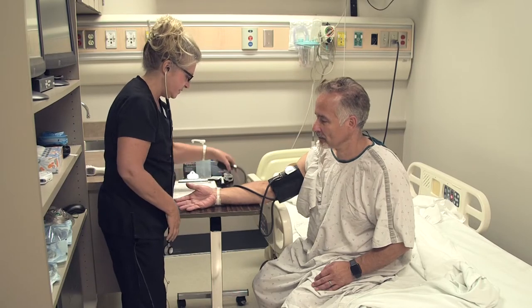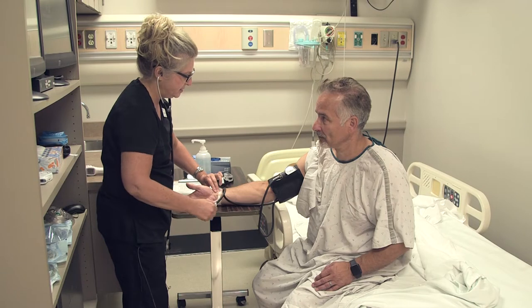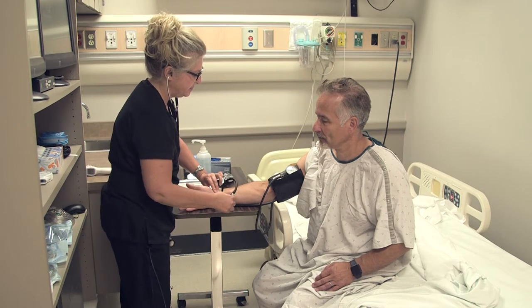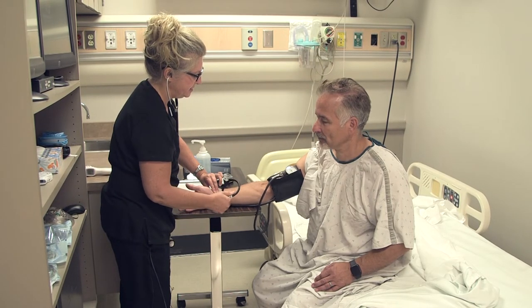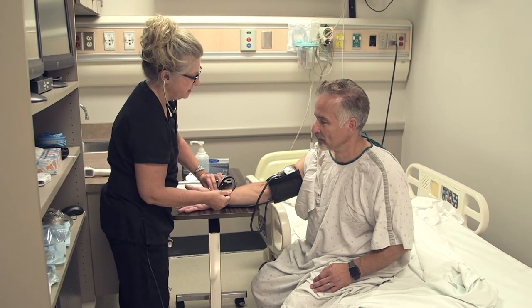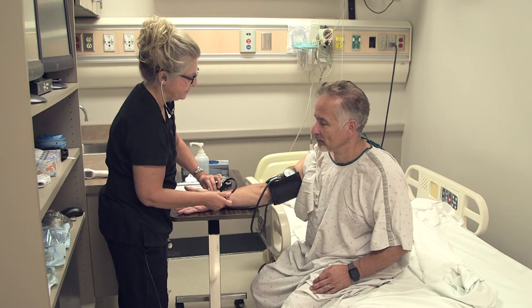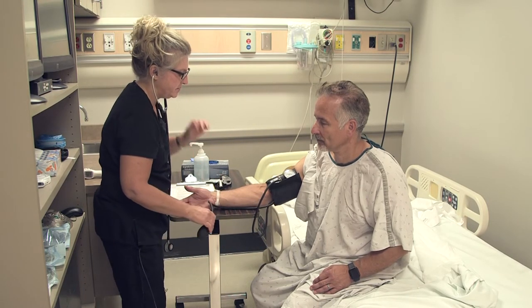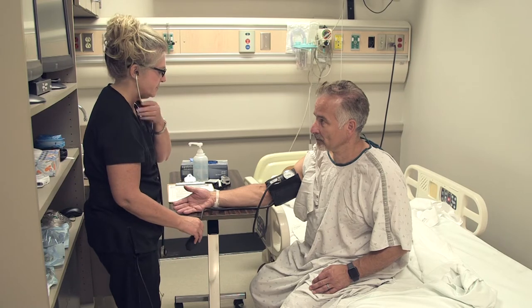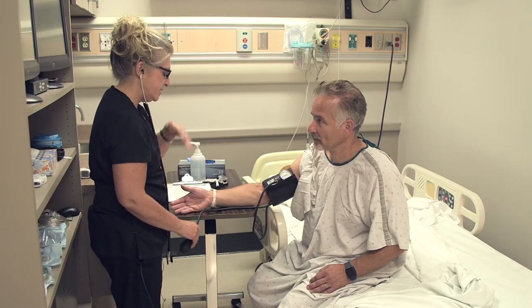All right, so first before we begin though, since you don't know where your blood pressure usually is, just going to get an idea here by pumping this up. It'll feel a little tight. Okay, good. Okay, great. All right, so now I have a good idea where you're at as far as your blood pressure goes. All right, so we're just going to wait a few minutes before I pump it up again.